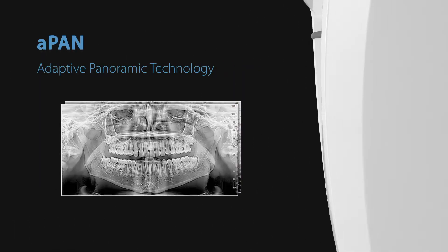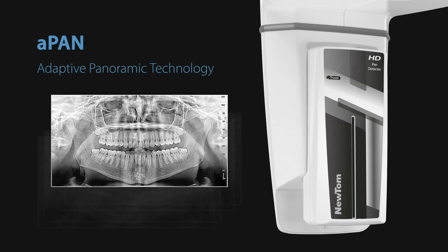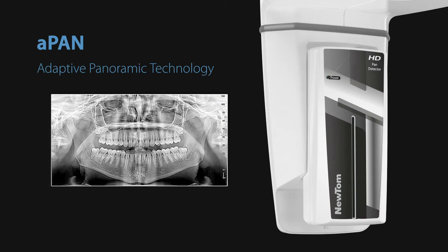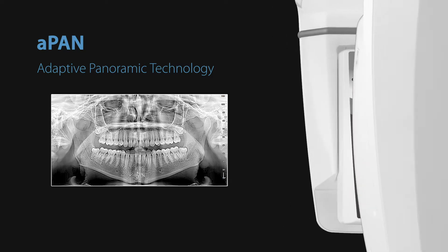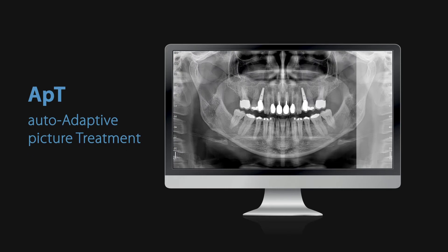NewTom Go captures five image layers in a single scan; then you select the one that best suits your diagnostic needs. Auto-adaptive filters automatically improve every 2D image to ensure the best results.